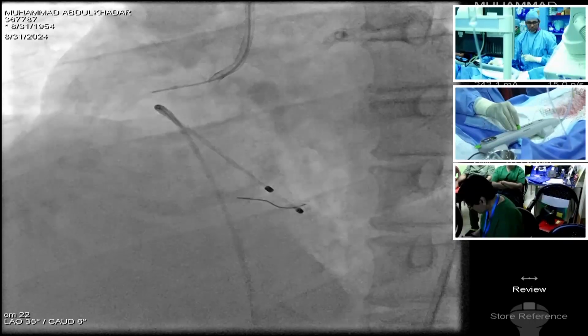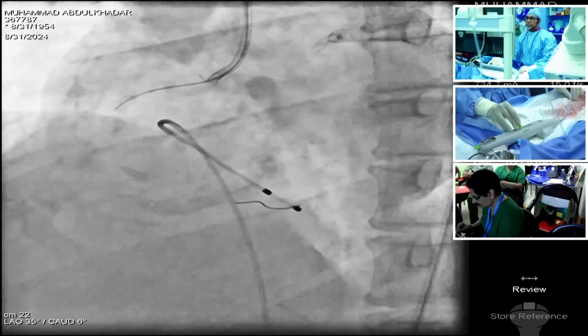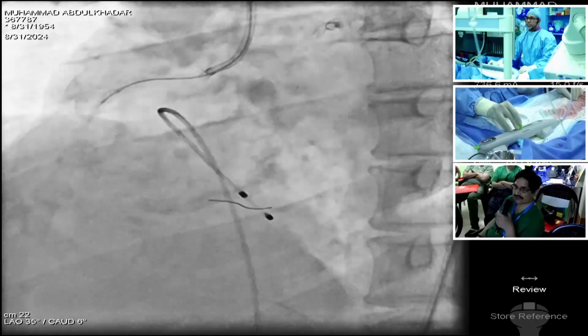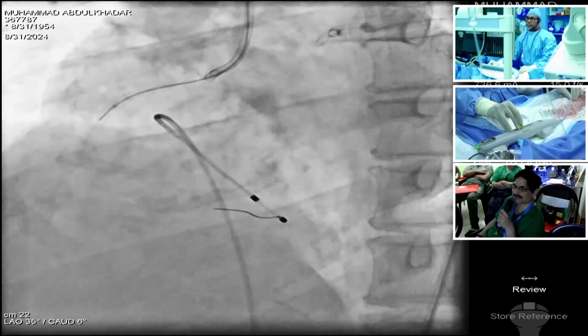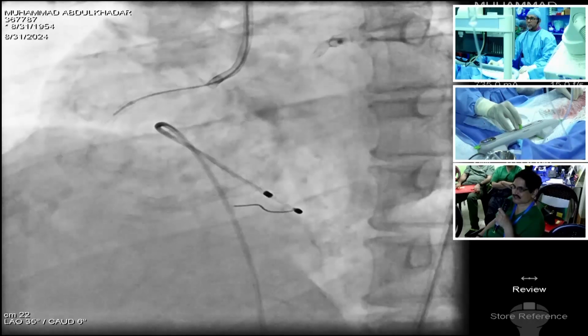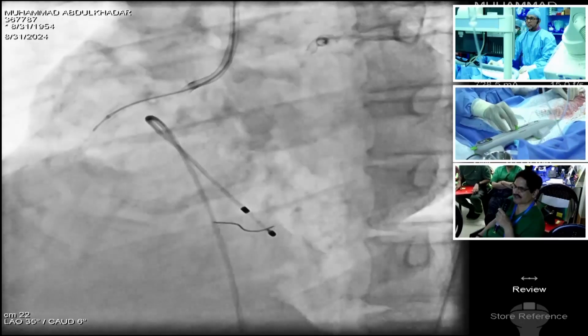So we are going for the next run. You see damping sound. Yeah. And now it crossed. You see how it crossed? Unlike a rota, it is a very, very little jump.